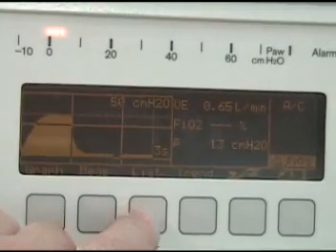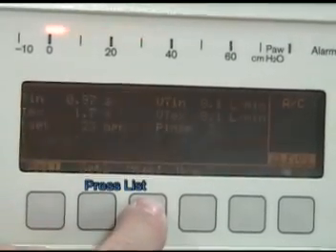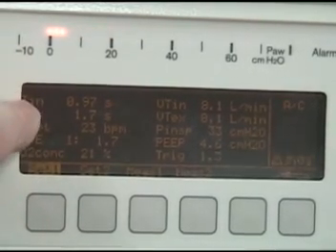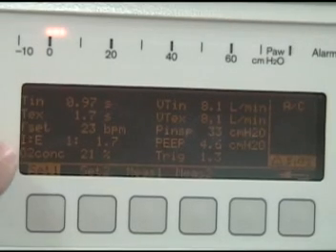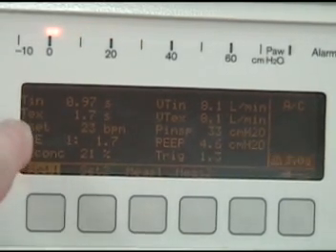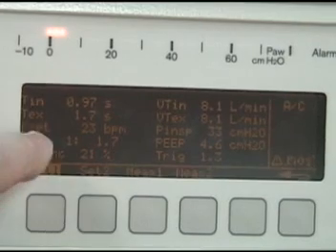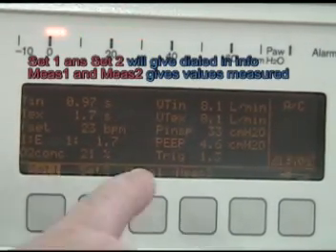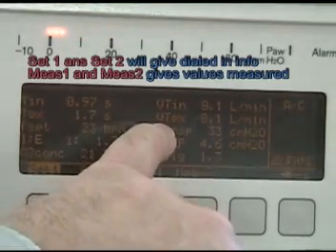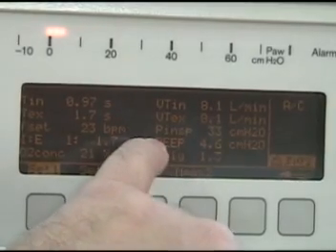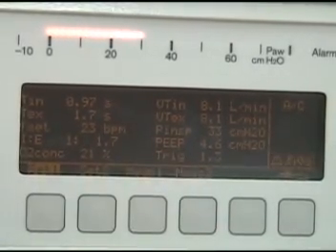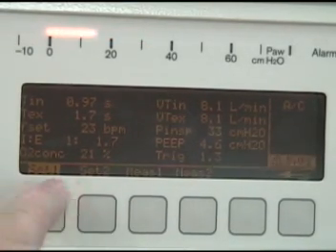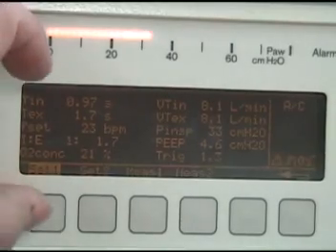If we press list, we can get a nice listing of all the information on the ventilator: the inspiratory time, expiratory time, the set frequency, the O2 concentration, the I to E ratio. So you don't really need to try and calculate this out. You have your inspiratory time, your peak inspiratory pressure, PEEP, and your trigger sensitivity. That's the information in set one.